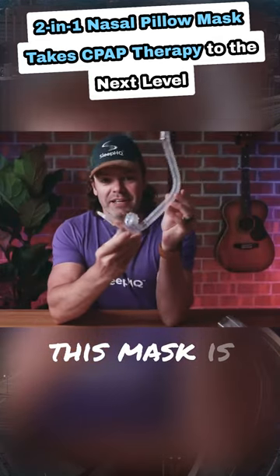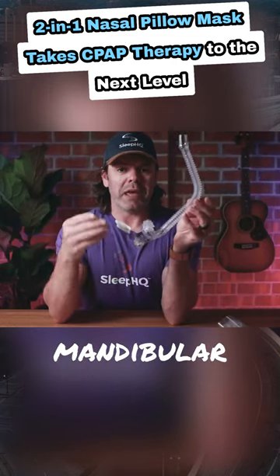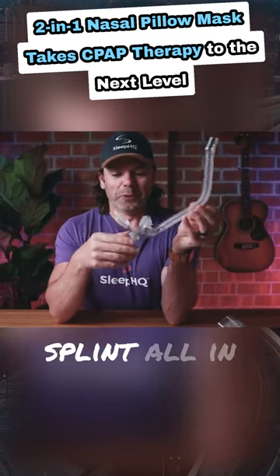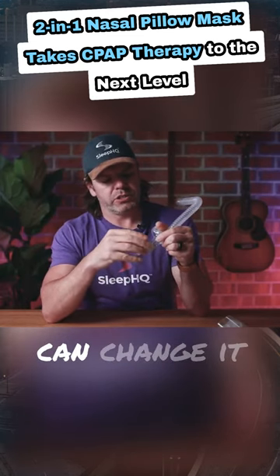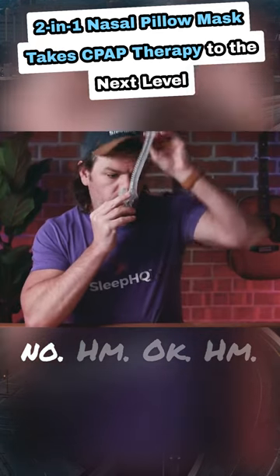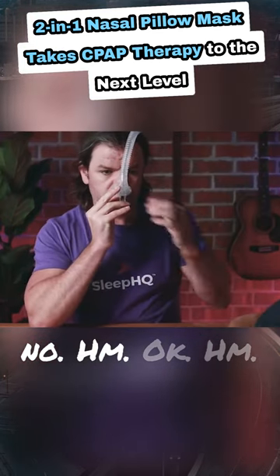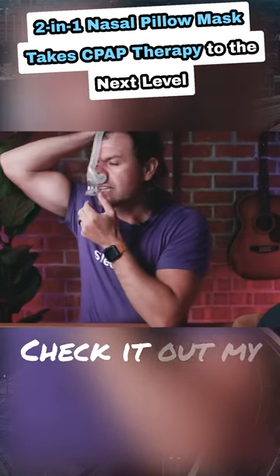This mask is like a nasal pillow mask with a mandibular advancement splint, all in one. It's got a little system here that you can change. Okay, there you go — check it out.